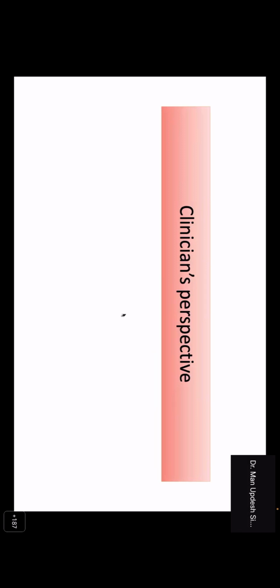Any questions on this at this time? Yes, sir. We have two questions. The first one is, when we do bone marrow cell count, should we express it as percentage of all nucleated cells or percentage of WBC series only?